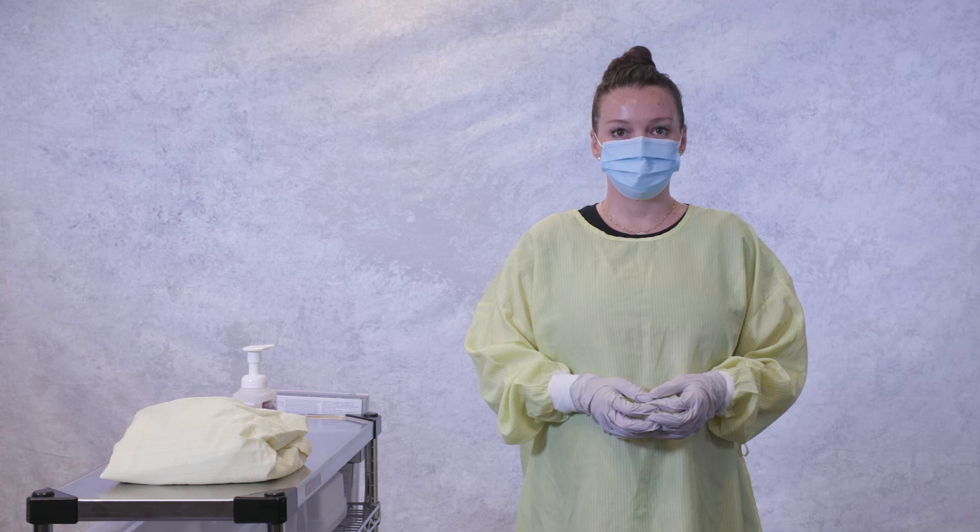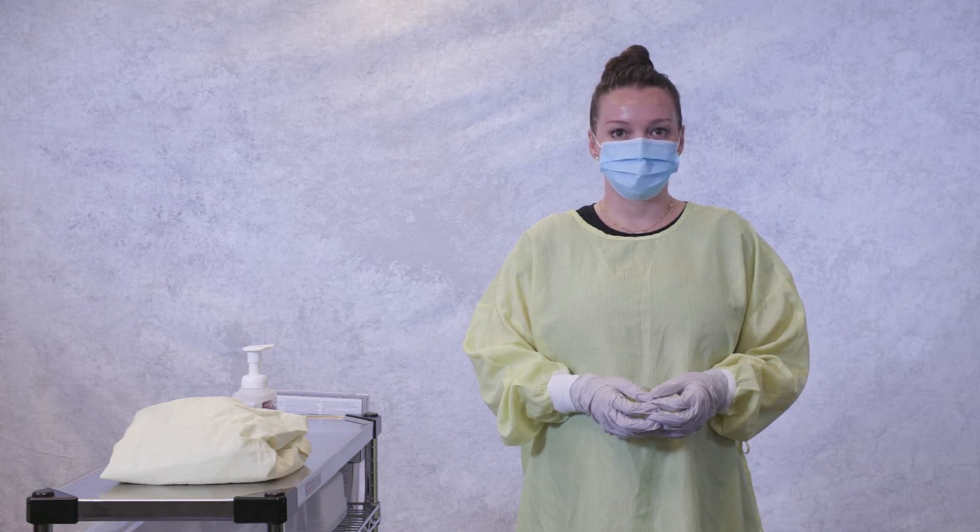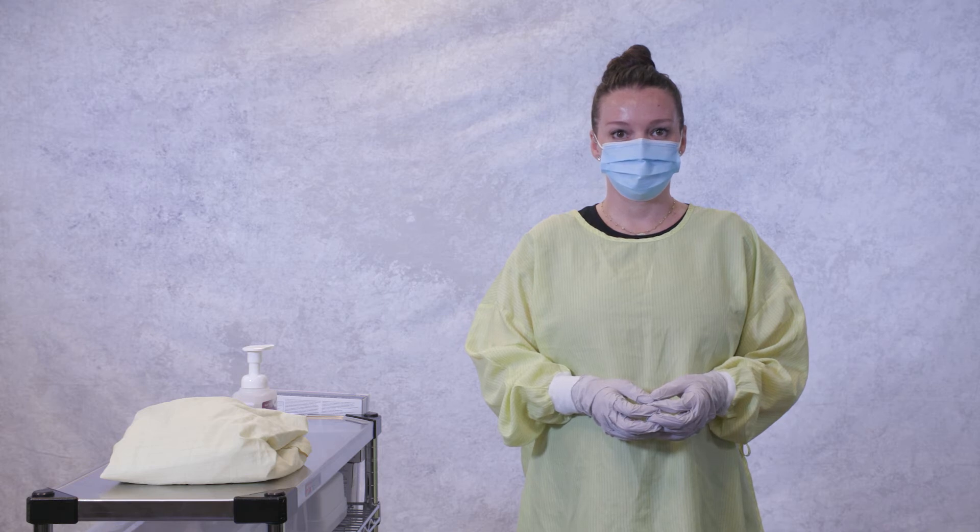Doffing PPE correctly is critical to preventing contamination. Doffing should be slow and deliberate. Take a moment to pause and assess after each step. Whenever possible, it is best to doff gown and gloves inside the patient room to avoid contaminating surfaces outside the room.